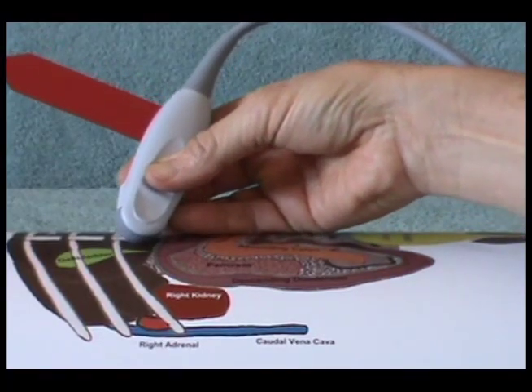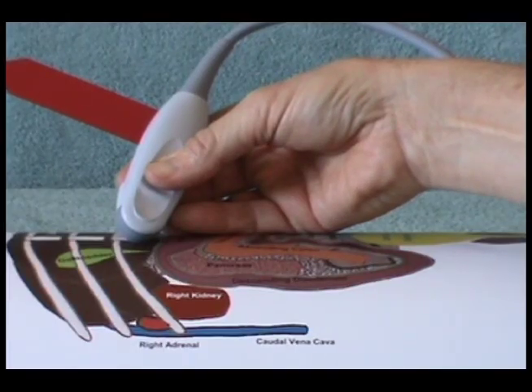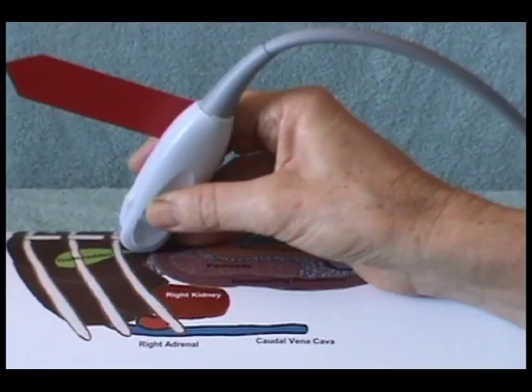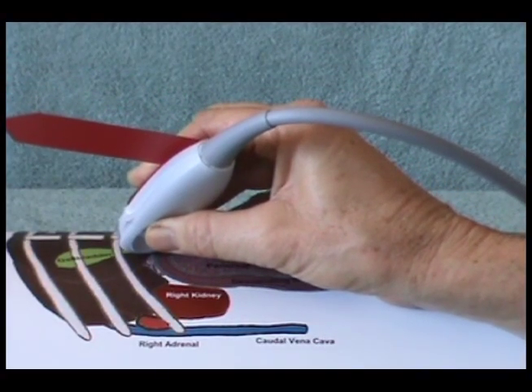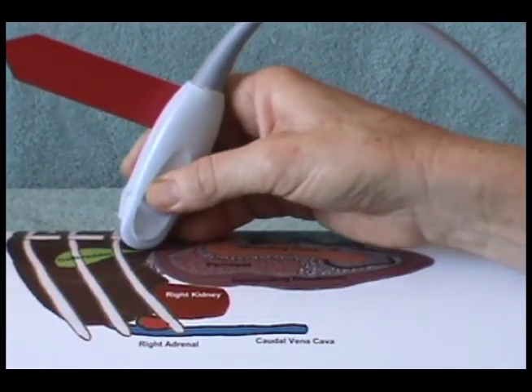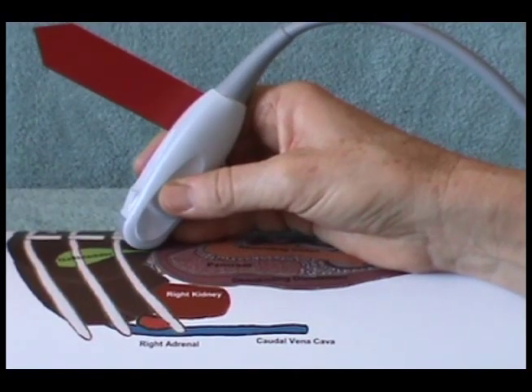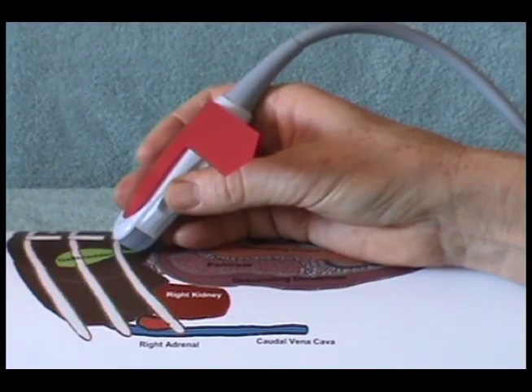Continue to fan to the patient's right till the transducer is no longer pointing at the gallbladder. Then reverse direction and fan to the patient's left through the gallbladder. Fan the transducer back to the middle point of the gallbladder. While pointing at the gallbladder, rotate the transducer 90 degrees counterclockwise to a transverse position. Do not change the angle of the transducer while rotating.